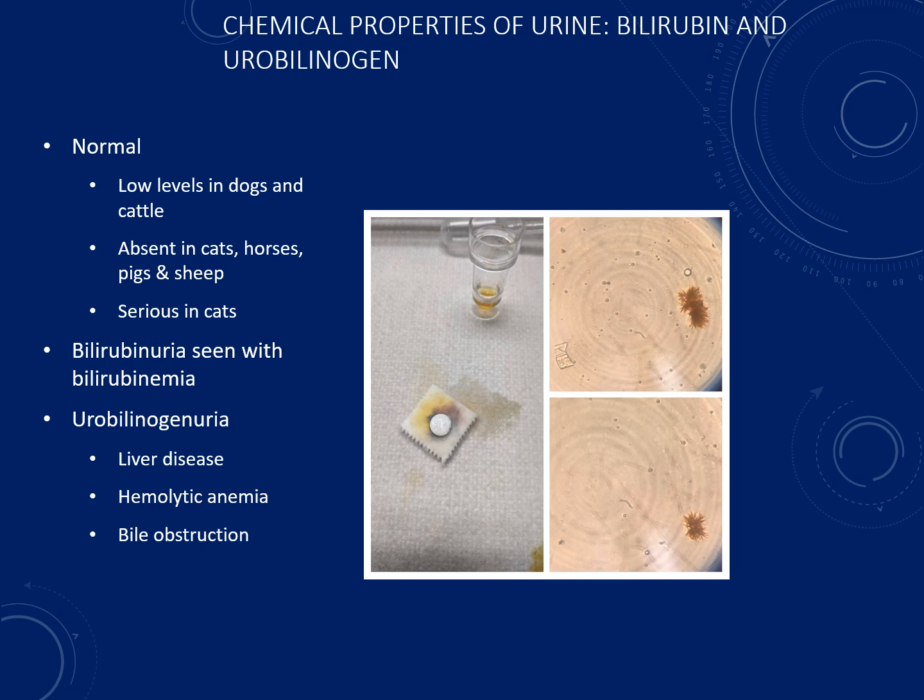If you look to the right here, we have two pictures. One is of a confirmatory test for bilirubin. In this test, the tablets are placed on a pad, and distilled water and the urine sample are added, and a purple color change will indicate positive for bilirubin. When the bilirubin is positive on your reagent strip, you may also see bilirubin crystals, which are brown, spiky-looking crystals.